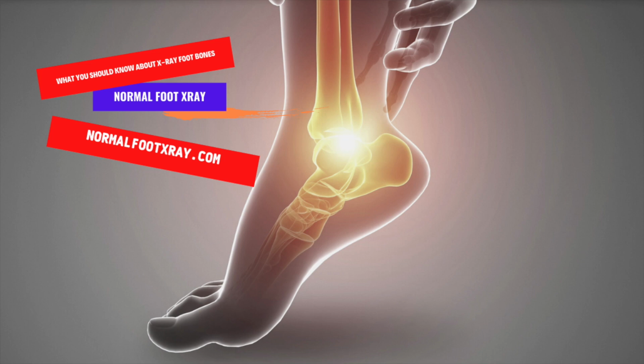What you should know about X-ray foot bones. An X-ray of the foot takes images of the bones in your feet. They appear as black and white photographs. Dense structures, such as bone, are viewed in the white part of the image. Soft tissues, such as fat, appear in the dark portion of the image.